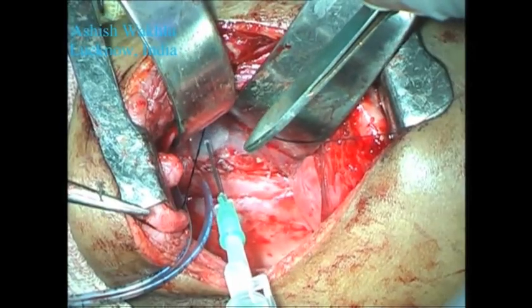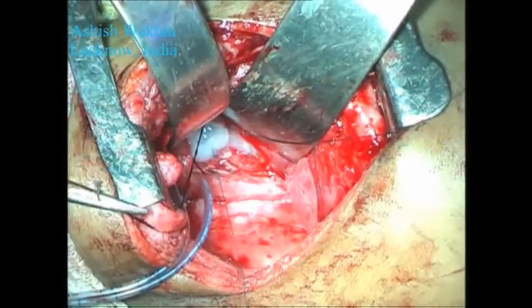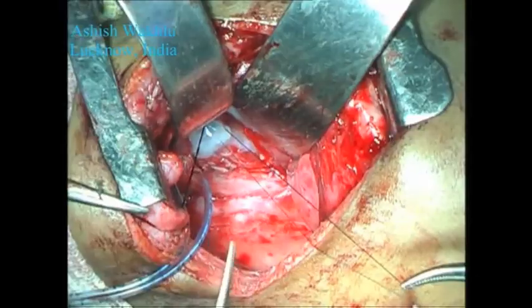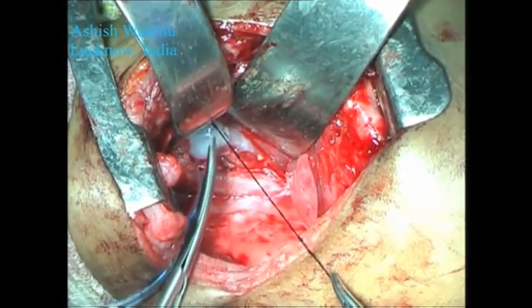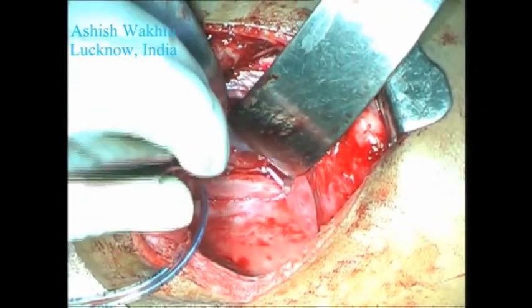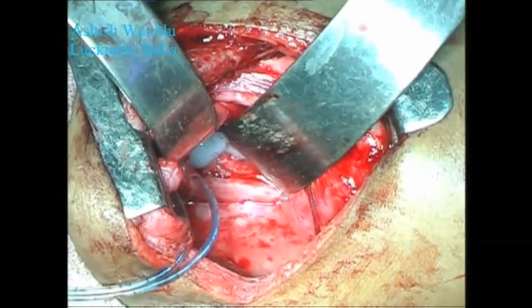For added security of the anastomosis, we are instilling tissue glue onto the bronchial suture line to prevent air leaks with inspiration and expiration. And we are now removing the stay sutures, and all that remains to be done is closure of the chest wall.